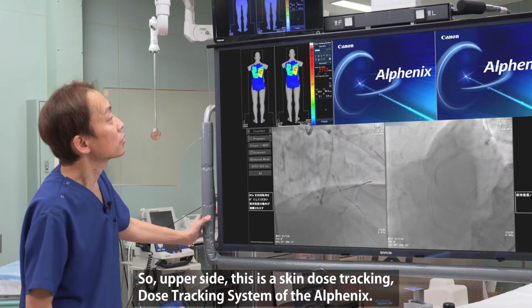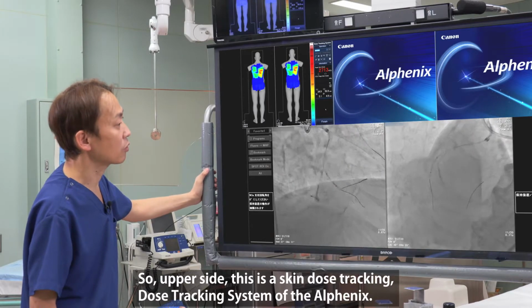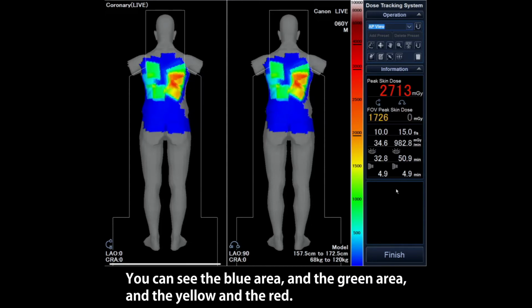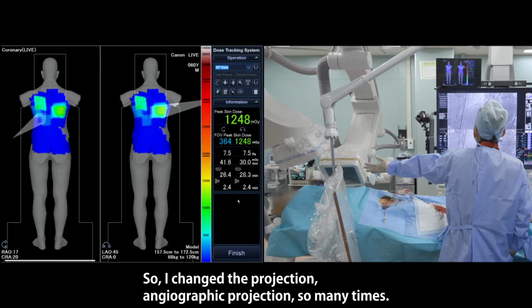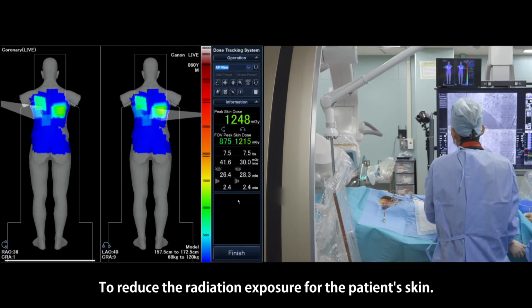So upper side, this is the skin dose tracking system of the Alphenix. So you can see the blue area and the green area, and the yellow and red. So the red area is higher radiation dose, but I want to avoid making a hot spot, red area. So I changed the angiographic projection many times to reduce the radiation exposure for the patient's skin.